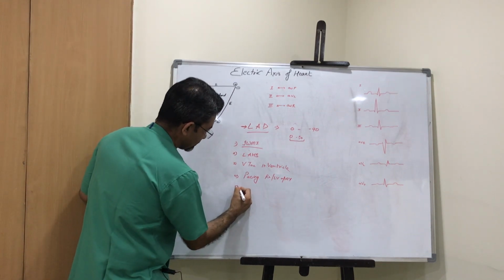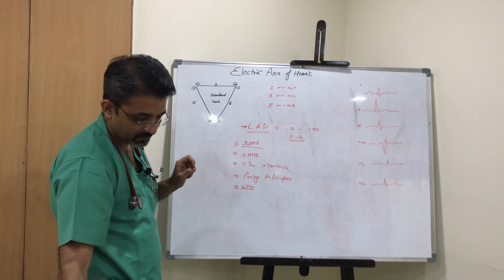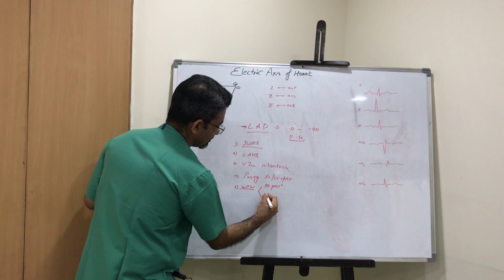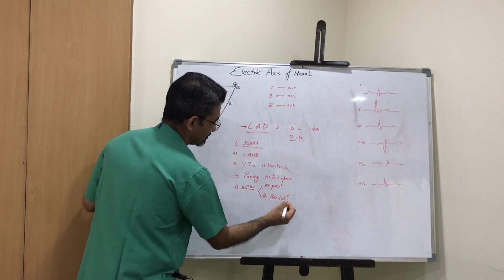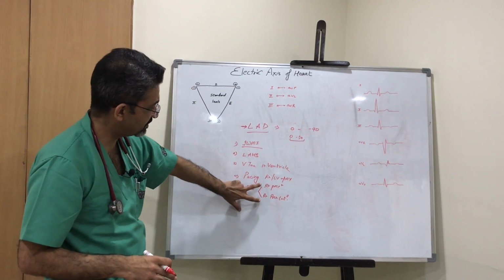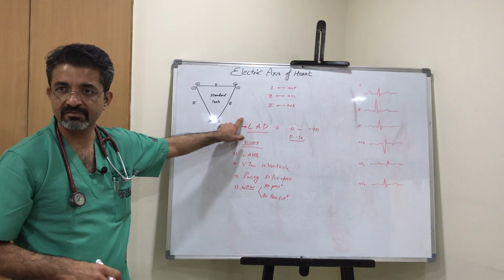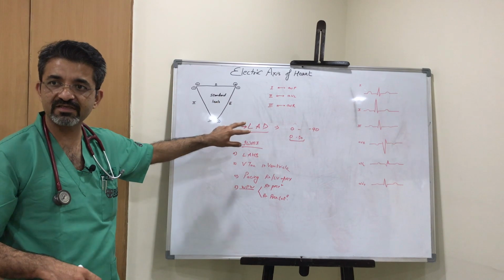Lastly, you have Wolff-Parkinson-White syndrome, wherein you have some tracts known as right posterior or right posterolateral tracts. They are aberrant tracts. So if the activation is taking place either by right posterior or right posterolateral tracts of WPW, you have left axis deviation.